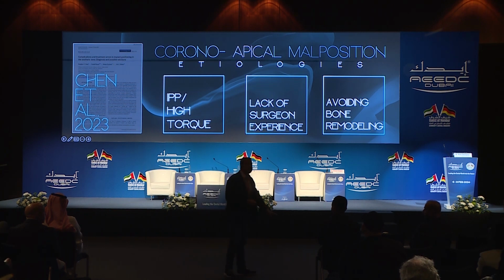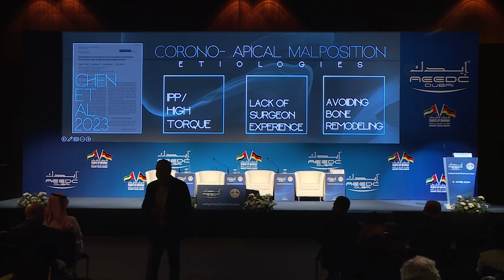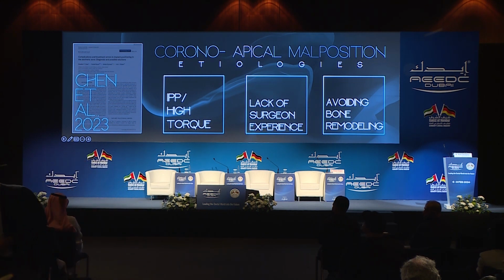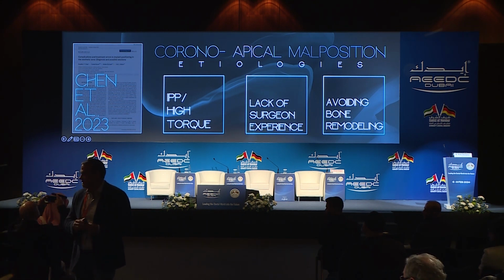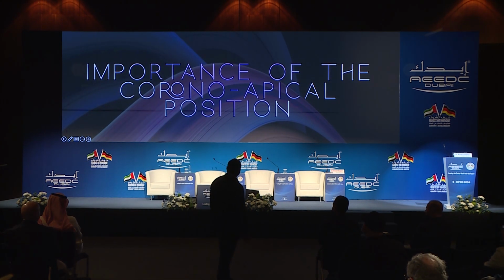The reason why surgeons place the implant too deep is, if they're doing immediate loading, they keep on pushing the implant to get a high torque, so they have primary stability. This is reason number 1. Reason number 2, lack of experience. And reason number 3, if you're young and you're placing your implant, you're scared that you're going to have some bone loss and some bone remodeling, and you don't want the titanium to show. So we keep on pushing our implant too deep, right? And these are the common mistakes that we see in today's implants in the aesthetic zones.